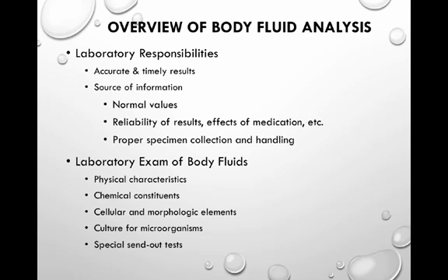So they need to be handled with care. We don't want to have to go recollect a specimen. A lot of times that's just not able to be done. So we have to be very careful with how we handle the specimens. We offer tests on these body fluids, and we have to be able to provide accurate and timely results.